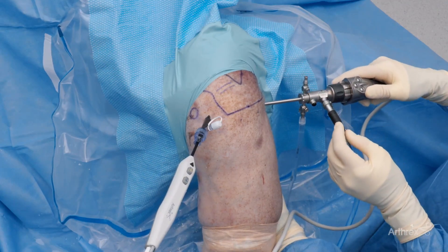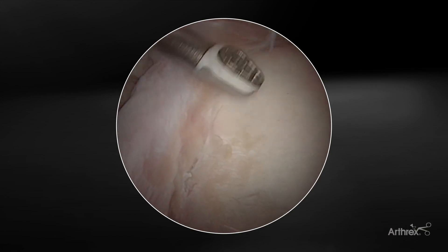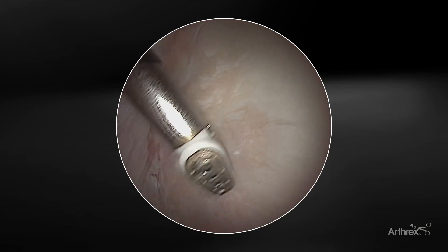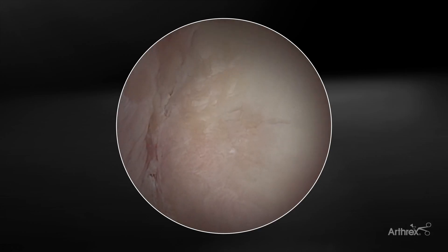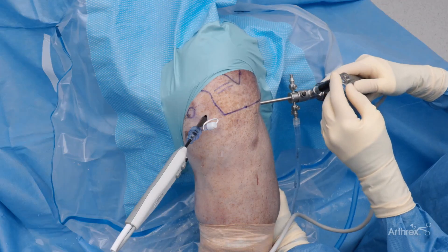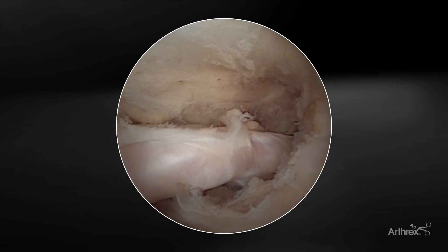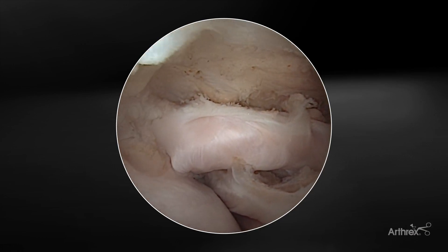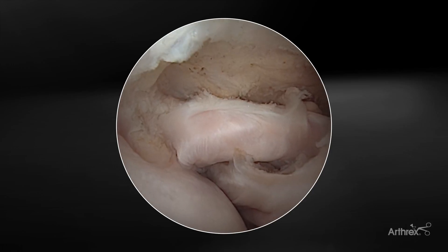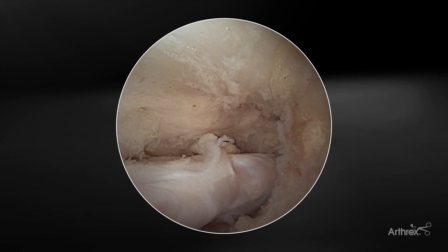Looking at the labrum now, the degenerative tear is stabilized, frayed tissue has been tapered, with minimal impact on the surrounding tissue. Looking at the glenoid, we can see that the cartilage lesion is stabilized with less degenerative frayed tissue after treatment with the i90. And lastly, looking at that rotator interval, we can see that subscapularis completely mobilized and released, interval released in preparation for any potential subscapularis repair or work underneath the coracoid.